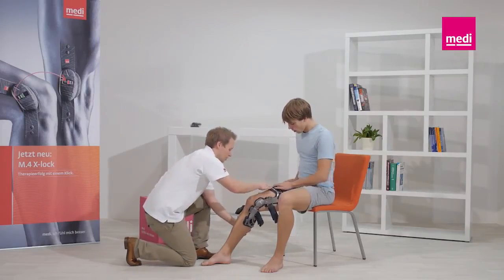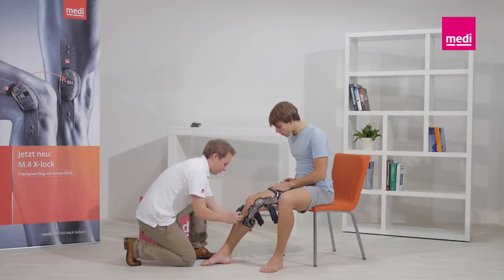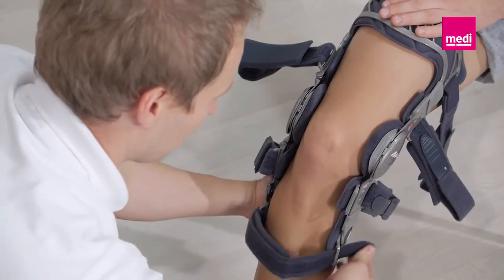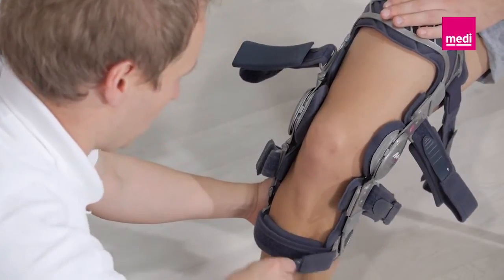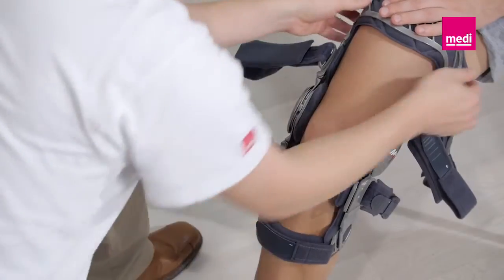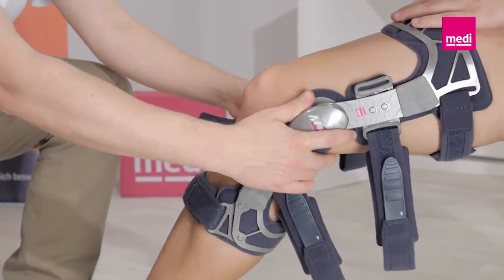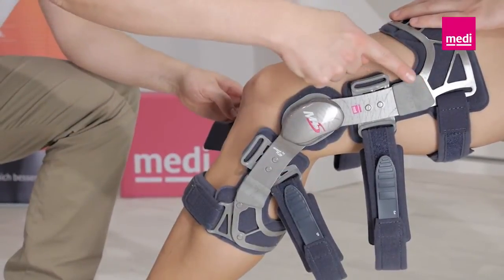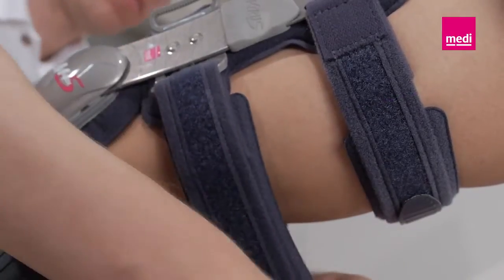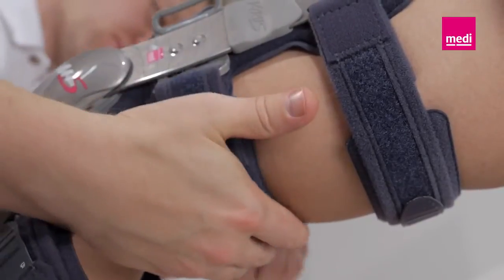Make sure that the orthosis is not twisted on the leg. The straps should be secured in the order specified by the numbers to guarantee the orthosis fits securely and has the optimum effect. Start with straps 1 and 2. The knee should stay bent. Now push both orthosis hinges backwards towards the back of the leg. Make sure that the hinges are positioned behind the lateral medial midline of the leg. Now fasten straps 3, 4, 5 and 6.